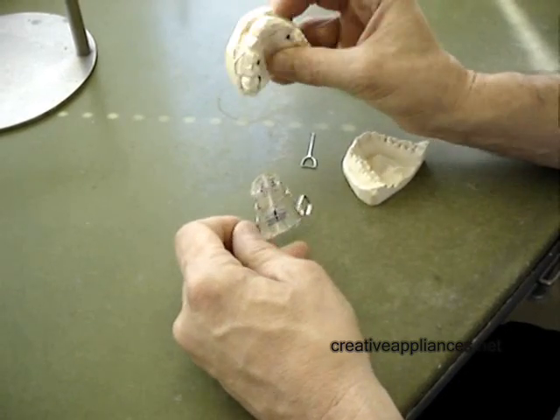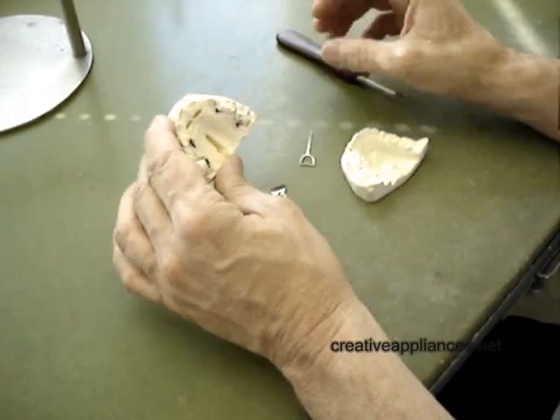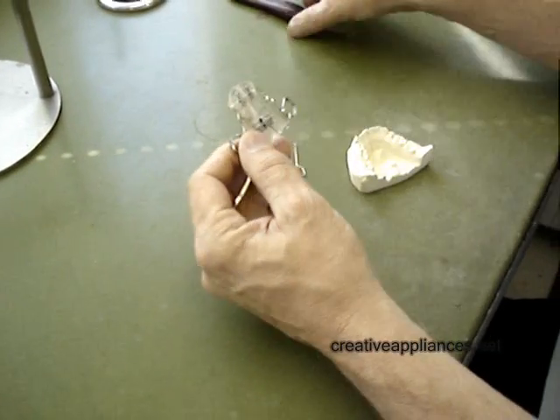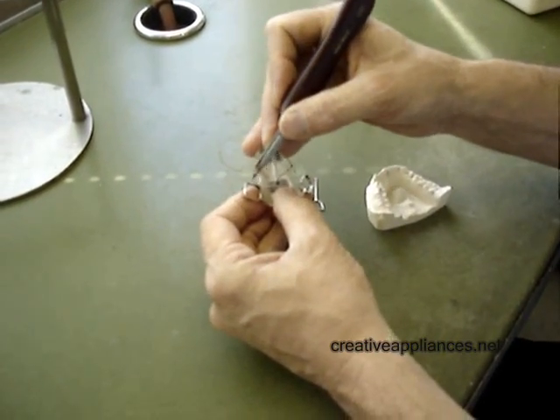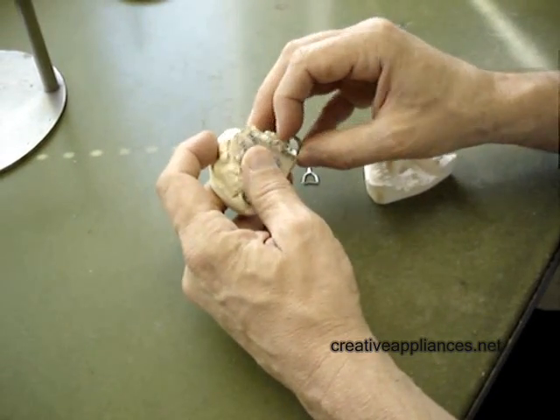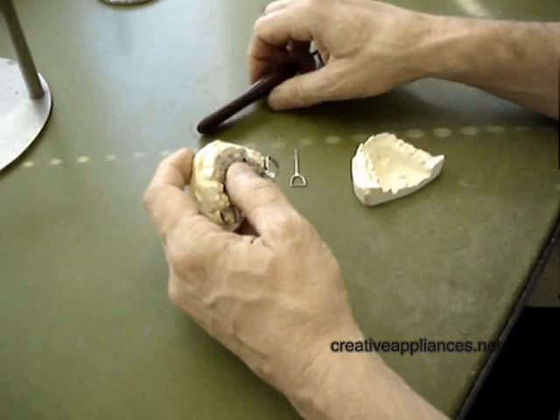This young man has a lot more permanent teeth coming in than he has arch space to accommodate, so this is an interceptive approach of widening the arch through the expansion screw, with bands on the first molars. At the same time, we find that by widening the arch we also have a problem with the anterior teeth being too lingual.